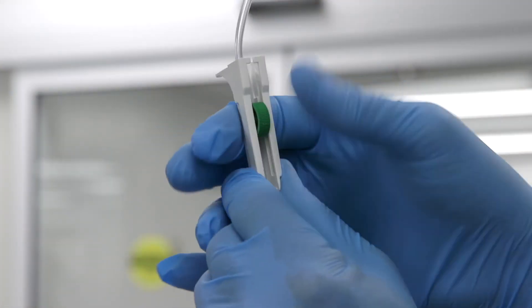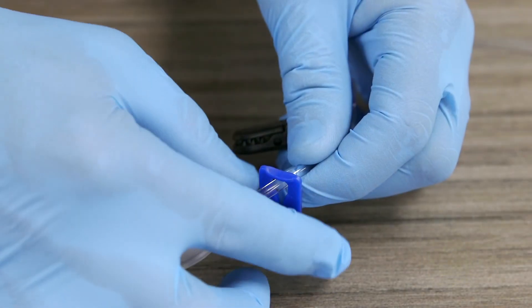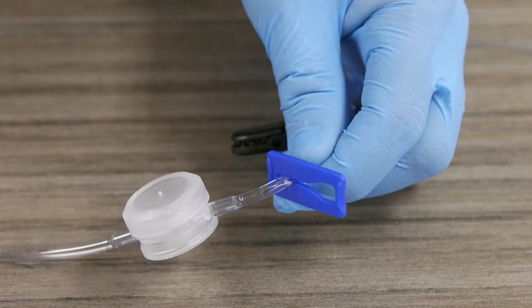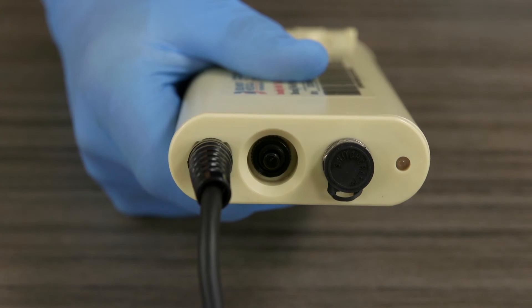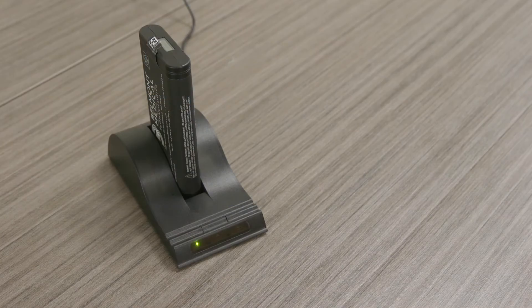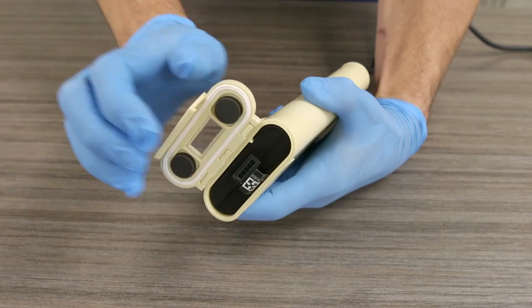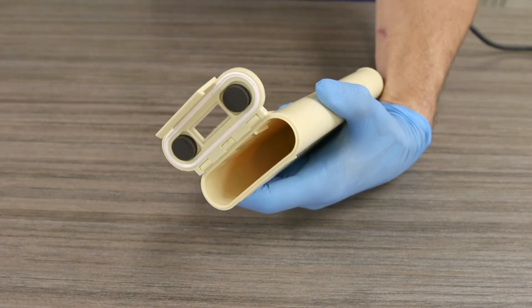At the end of the procedure, close the roller clamp on the administration set and then close the input end of the disposable set using the blue side clamp. Turn off the heater by pressing the on/off button on the battery housing. Unlatch the heater unit door to remove and discard the disposable. It is recommended to recharge the battery after every use. Remove the battery by pushing up on the latch of the battery housing door and pulling up on the tab connected to the battery.